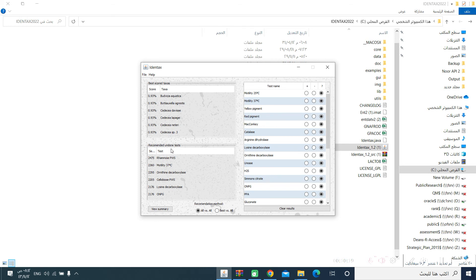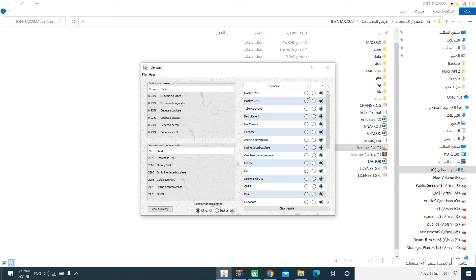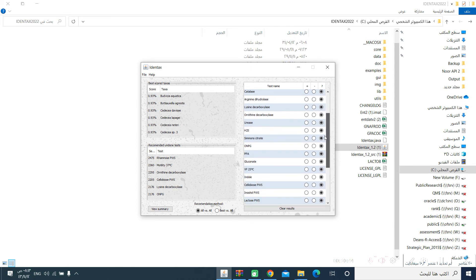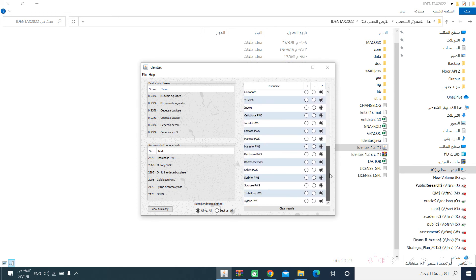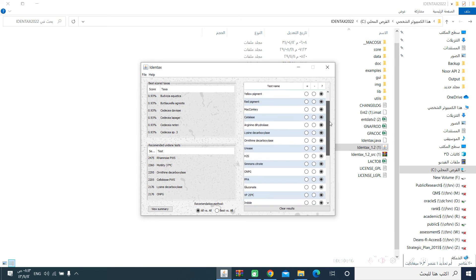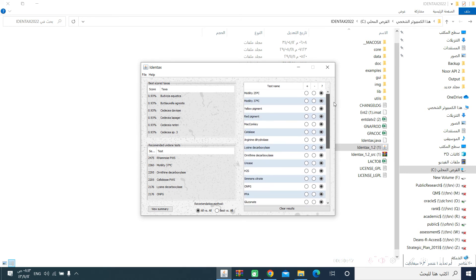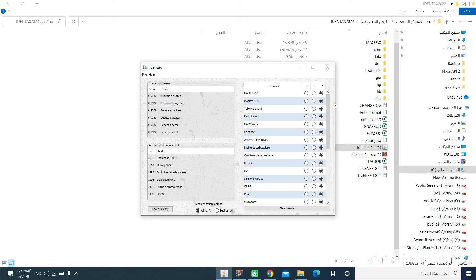The recommended undone test. This is a list of tests that is suggested by the software for you to further identify your microorganism. Let us start by selecting the positive and negative. We have three columns here, positive, negative, and none. So, you don't need to have all of these biochemical tests to be done for any of the organisms that you are testing.